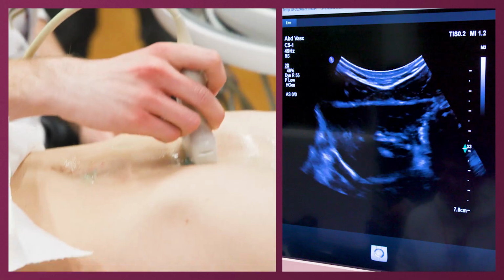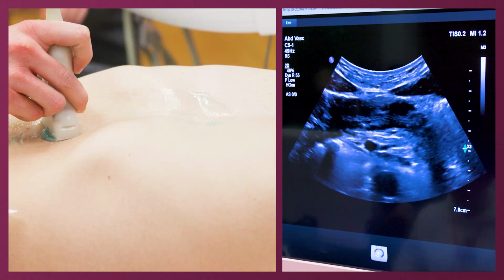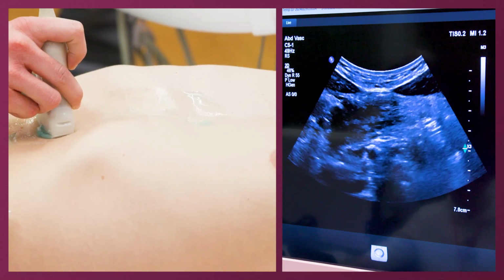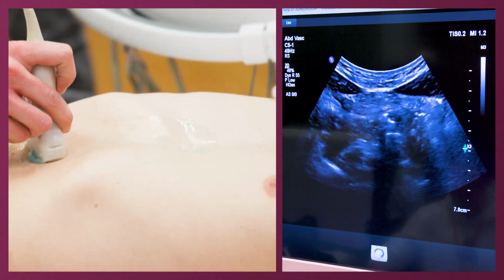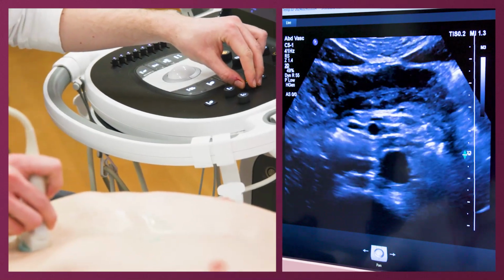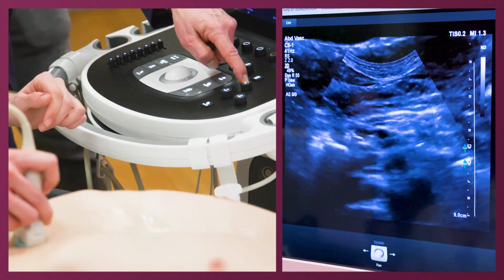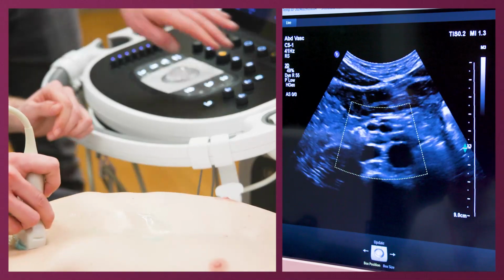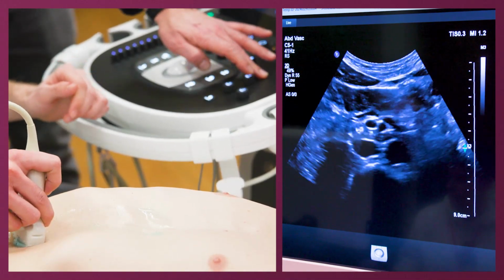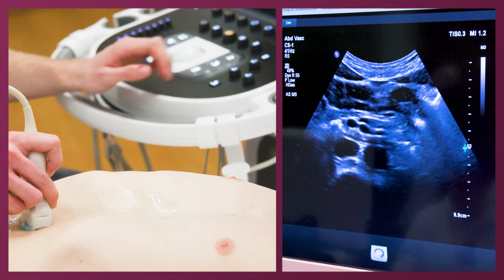But as a surgeon, you don't rely only on ultrasound because you want to see the distance from the. No, we don't plan surgery on this. It's just for follow-ups, to select them for surgeries, and if they approach the surgical threshold. I think it's zoomed. I have to remove this. Now it's raw. And here you have the aneurysm.